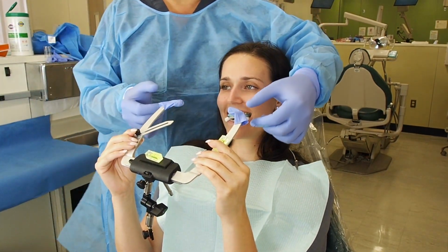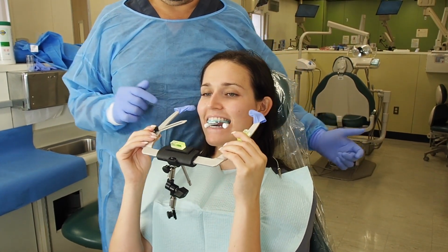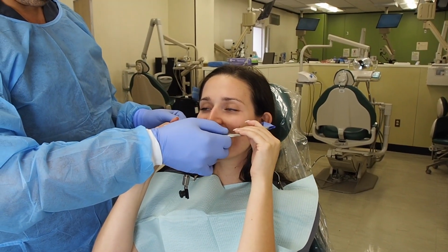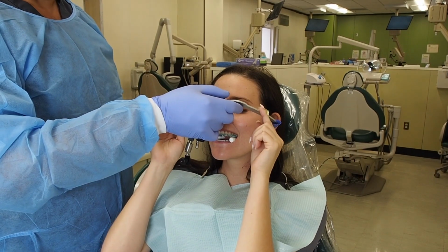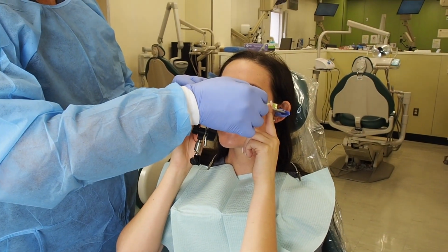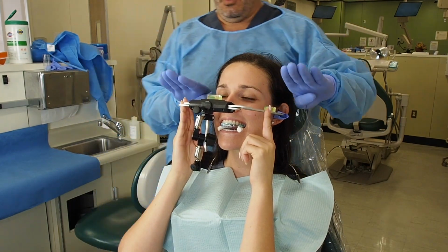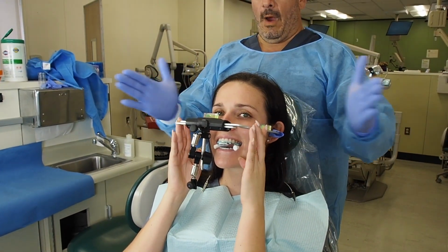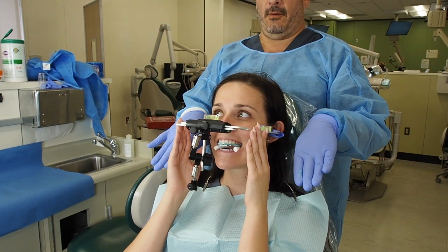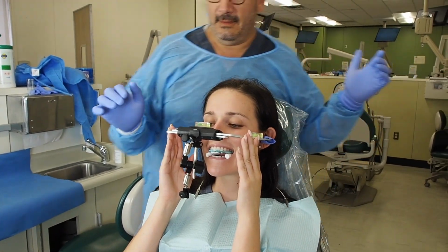Then I will ask my patient to put these in the earlobes as if they were Walkmans, earpods, headphones. Hold it there, have it inside. Okay, I'm gonna try to close it as much as we can, and this is giving me the axis of how wide and the position of how this mandible will open and close. So you know how wide the condyles are in this section.